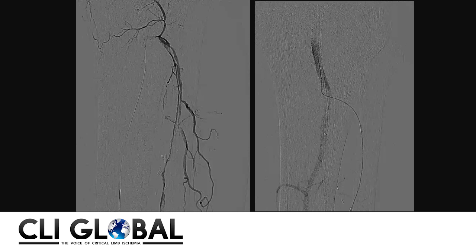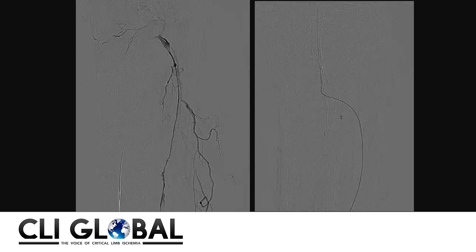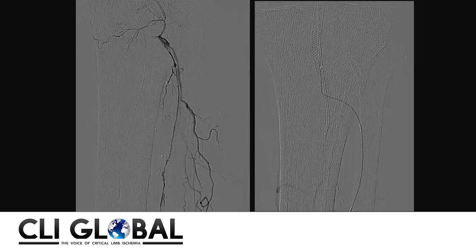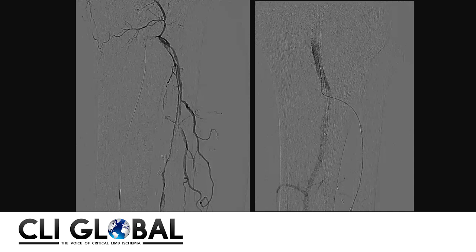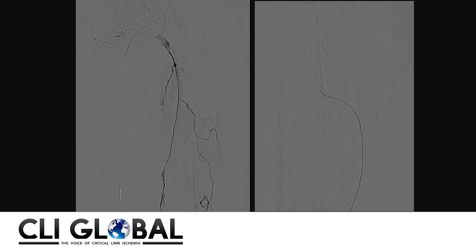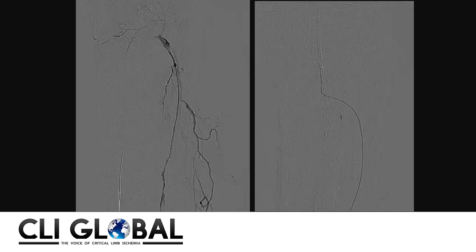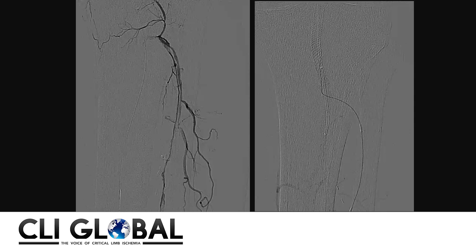We proceeded with accessing the dorsalis pedis artery and anterior tibial artery in retrograde fashion. On the first angiogram you can see the dissection in the proximal anterior tibial artery — that's what we noticed in the first case and was probably the reason why we lost the anterior tibial artery in the first place.